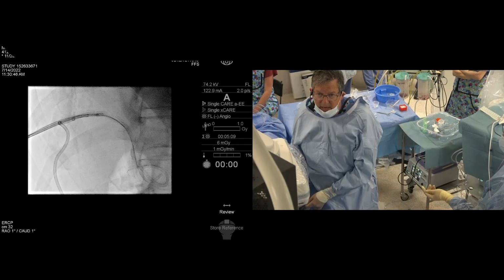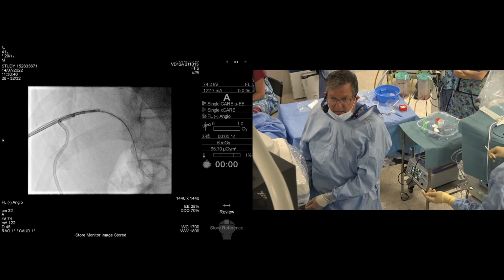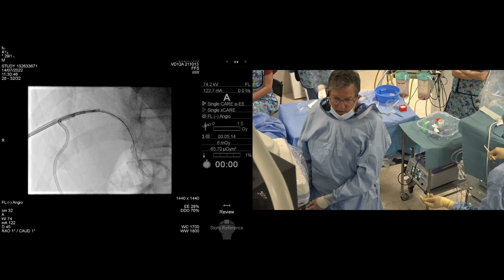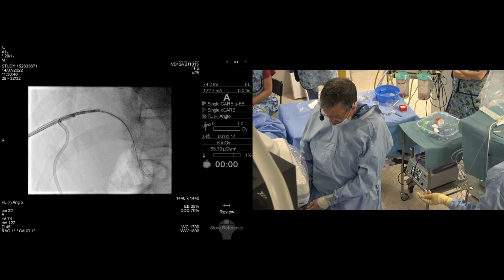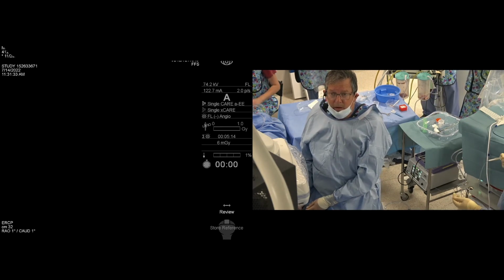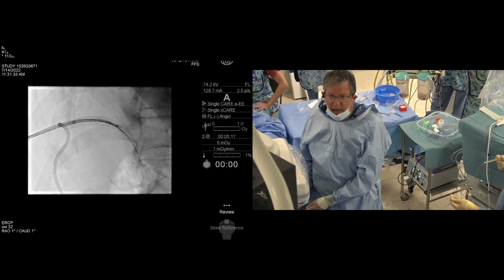Now, I would just say that if I was doing this biopsy simply through the sheath and not over the wire, at this bend that we're approaching, there would be almost no chance of the biopsy forceps going around that bend, and there would be a risk of causing trauma. So we may cause trauma and we wouldn't reach where we need to biopsy. That's avoided with this technique. Screen, please. I'm just going to advance a little bit further. Beautifully round the corner there.